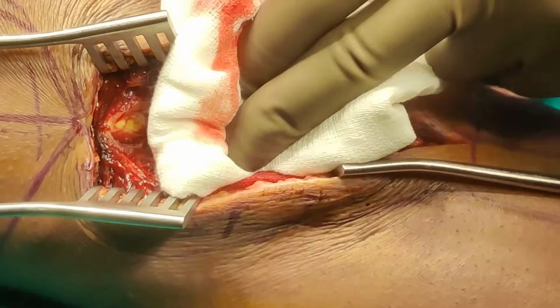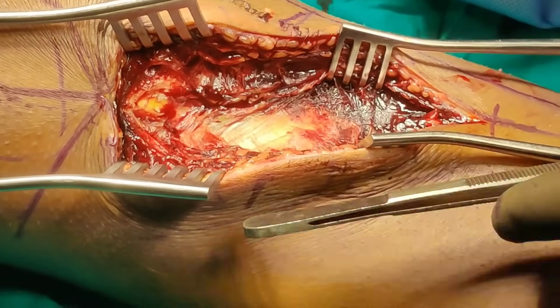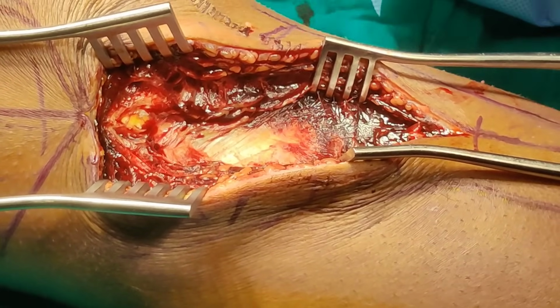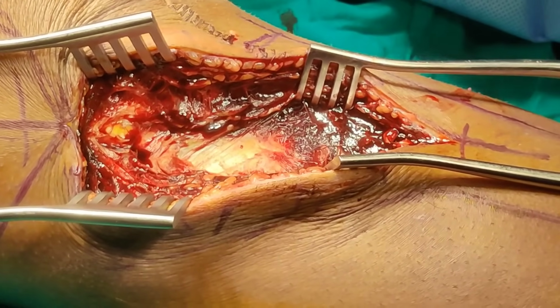So far I have not seen anything important. I have not seen the saphenous vein, I have not seen the saphenous nerve. Now usually they are a little bit on the back, so you don't always see them, especially in this approach. But when you are doing posterior medial, then there is a good chance you might find it. So let me continue my dissection.